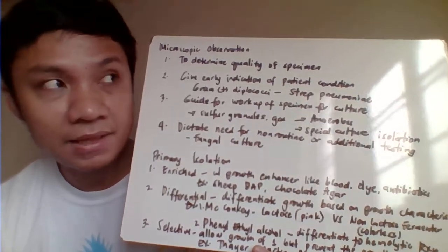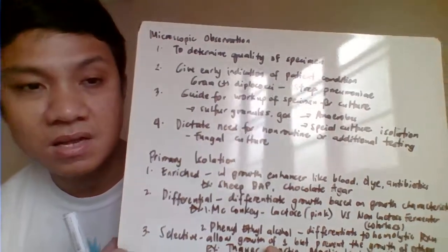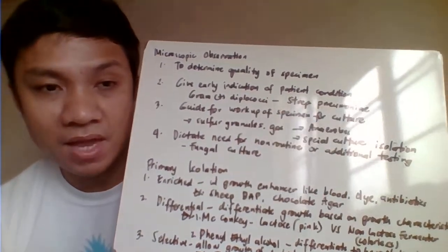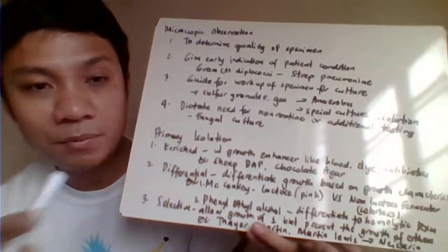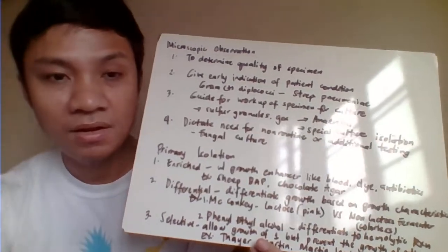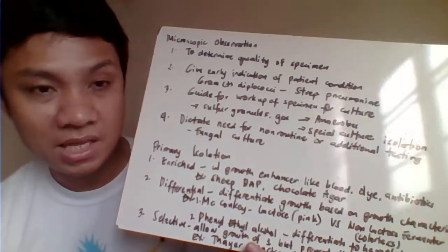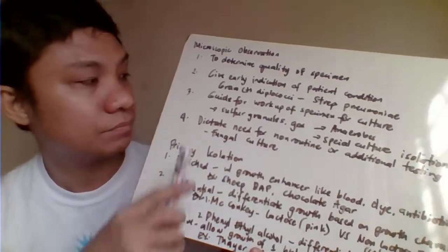And therefore, pag nakita na, okay, so Strep pneumoniae because of this characteristic under the gram stain under the microscope, the physician could start giving an antibiotic for that. So pag lumabas ang result, kung ano ba talaga na-identify at hindi siya Strep pneumoniae, it can shift to other antibiotic naman. At least, they have started already antibiotic treatment with your initial gram stain result.